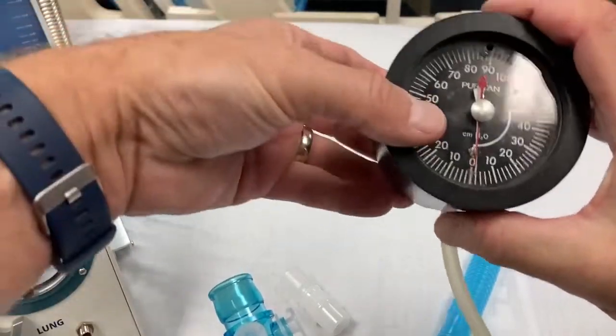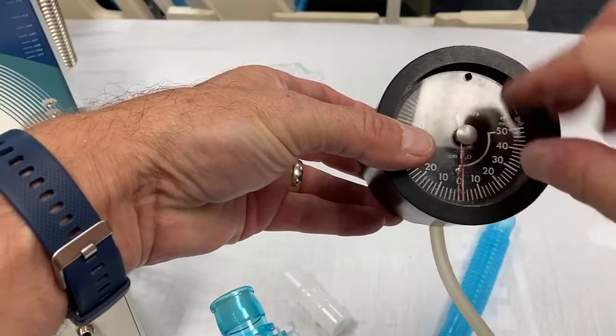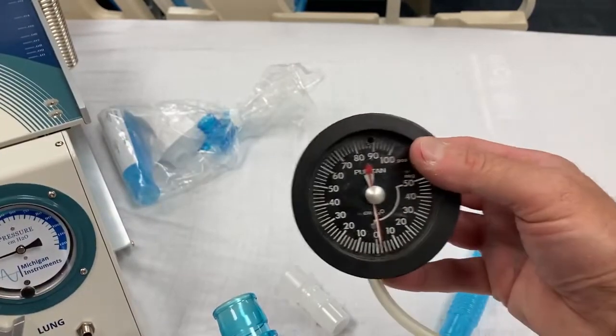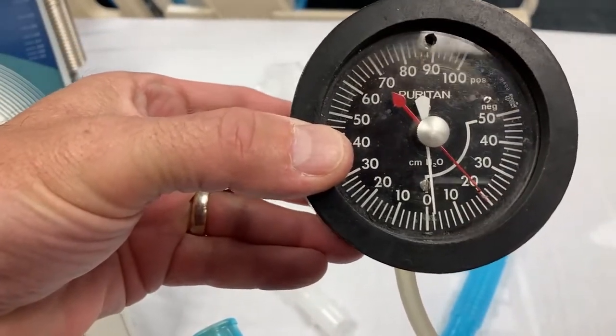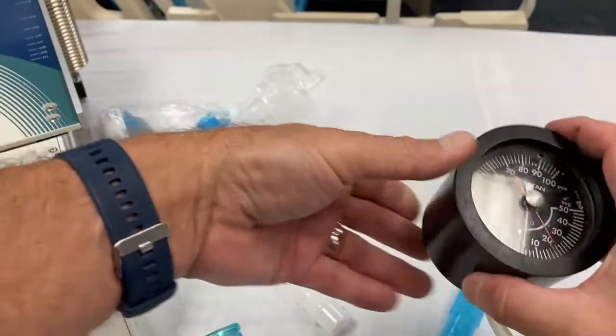Ours is not working very well, but a lot of them will have a little stopper thing that will move the needle. Actually, here, and it is working. So we'll do that again. Pull, pull, pull, pull, pull, and then it moves the needle, and it will hold your spot right there. So that would be -20, which would be minimally acceptable.